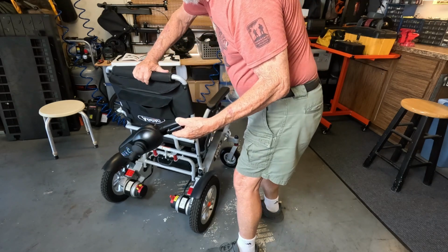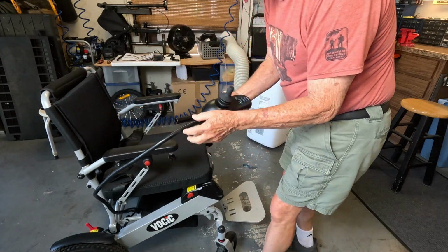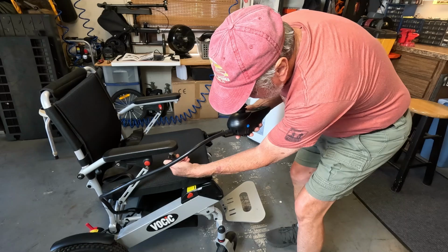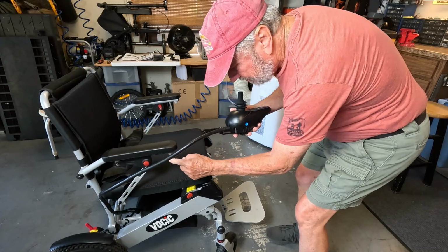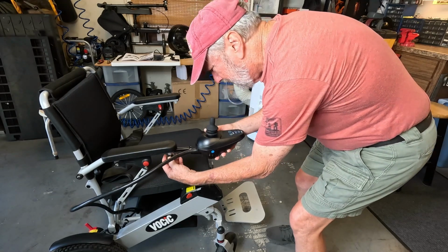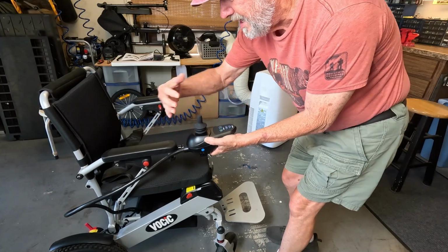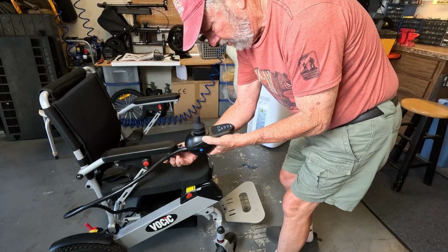Now at this moment is when we want to install this, and right here on the bottom is a groove. What you do is loosen this, and you put your finger in there. You can feel the top of this screw, and it will fit right into a hole up under there. Find a comfortable position. You can move this in and out for your arm length. For right now, we're going to just put it right at that position.